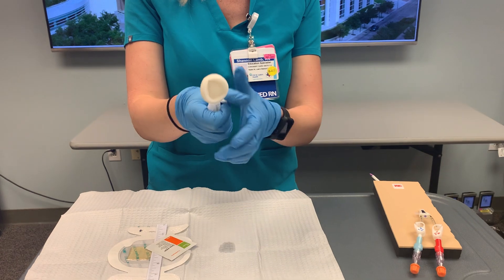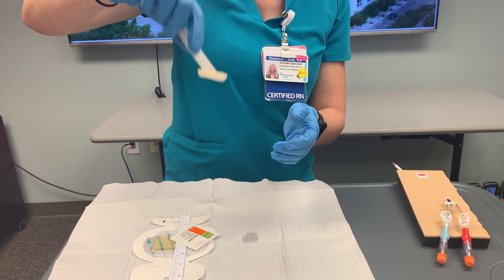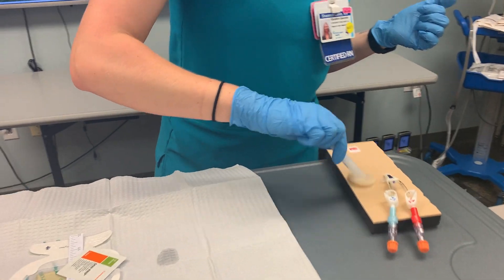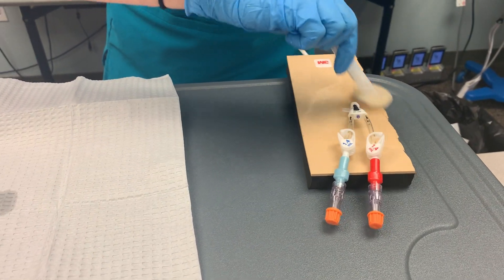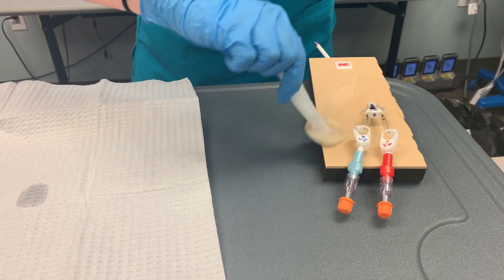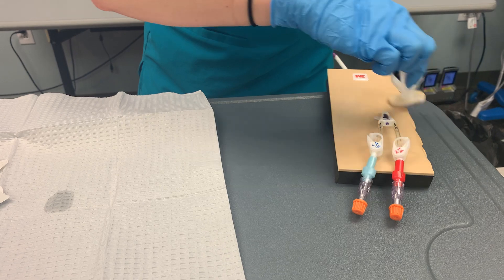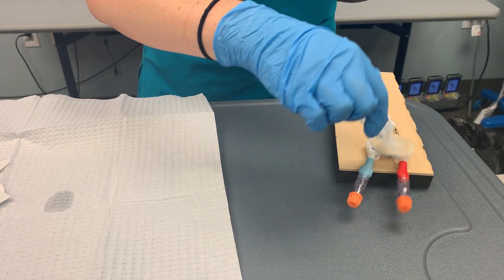For our chlorhexidine, we need to crack the wings — you'll hear them crack — and then just let gravity pull the chlorhexidine out. You can test to see if some of it's coming out on your glove. I'm now going to start scrubbing vigorously back and forth using a good strong motion to clean and disinfect and allow the chlorhexidine to do its work. The friction is going to assist with getting rid of bacteria. The other key factor is the dry time — we need to make sure that we let this chlorhexidine dry fully and get a wet time of at least 30 seconds.